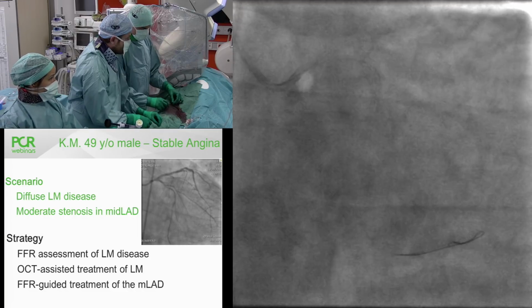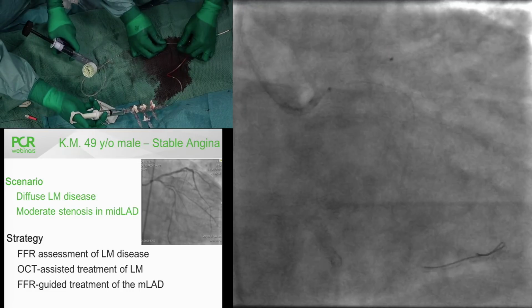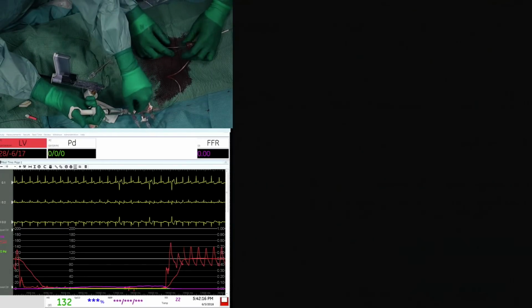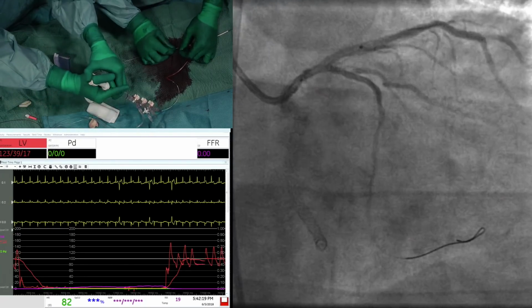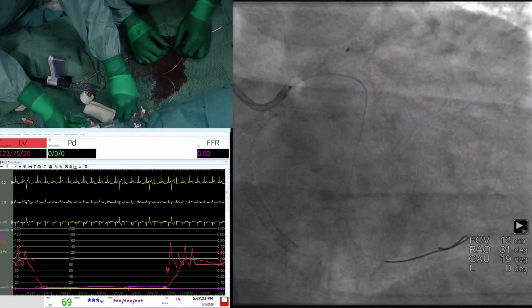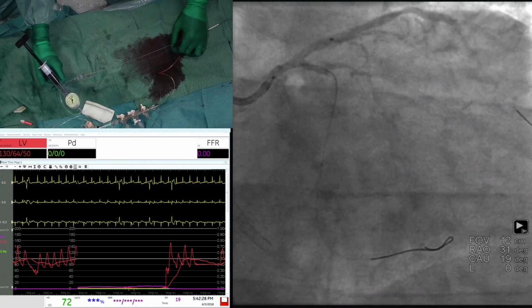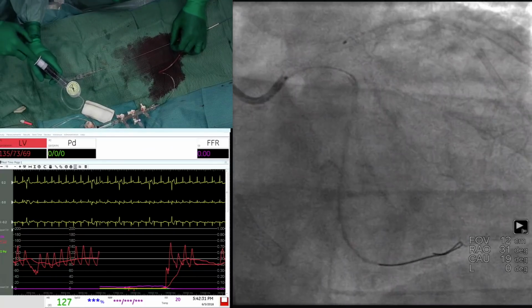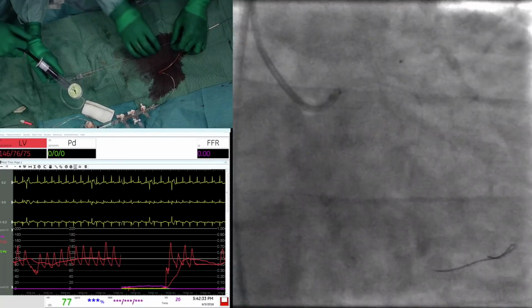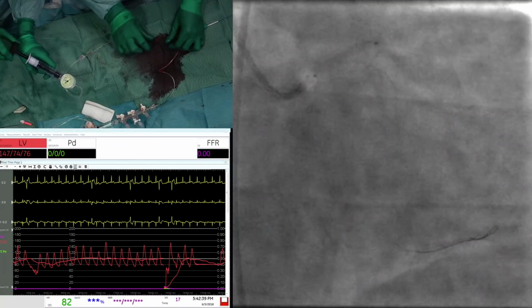3.6, as you mentioned. With a 3.5, we can almost reach 4, so we are going to give it a try. And again, we will use the balloon also to measure the length. Is that the best quality of scopy? It's not yet long enough, huh? No, I think a bit longer than 20 would be quite comfortable to position, right? We'll need a 24. Okay, you can inflate.